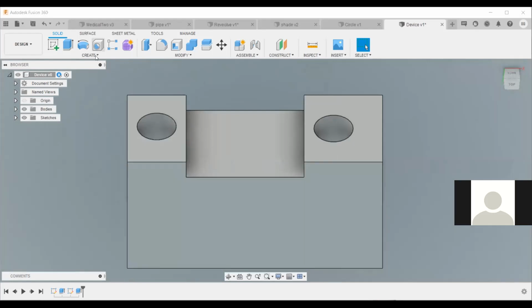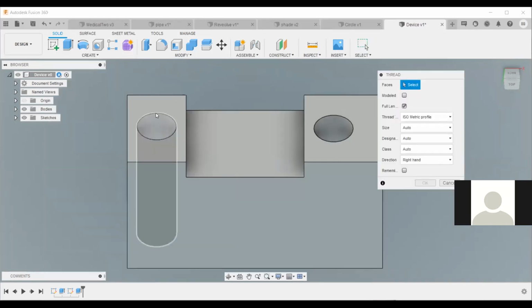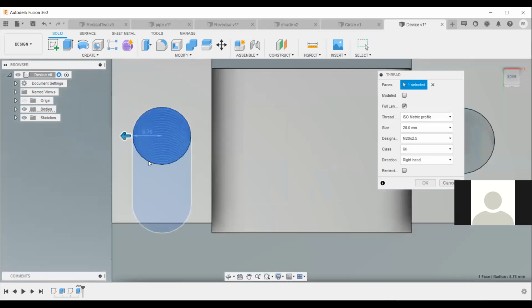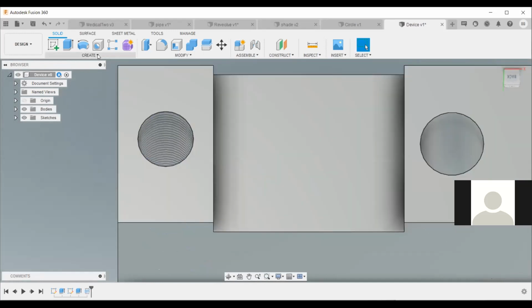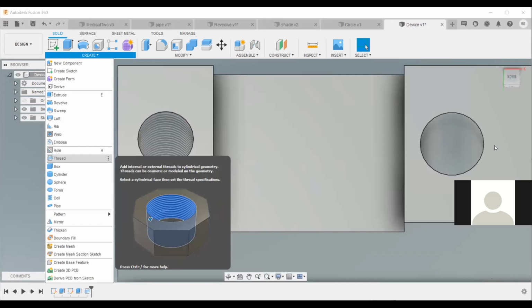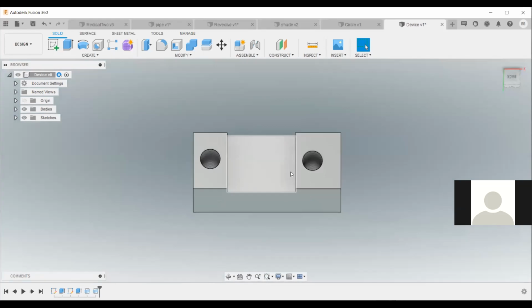Aya. So here you can create something. You can create a thread. So a thread is like for a screw to get in. Umeona hapo? Yeah. So I want you to just do the default 20 millimeters, hivyo. Then this side also, create a thread in both sides. So 20 millimeters default.